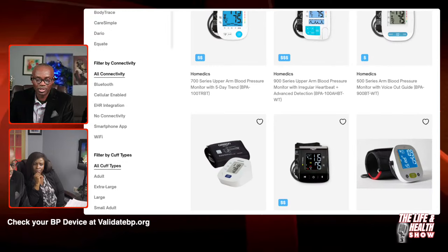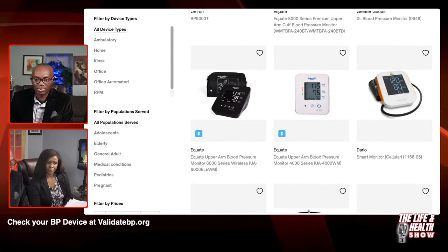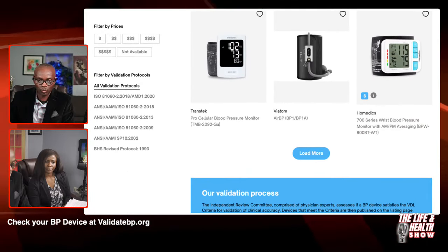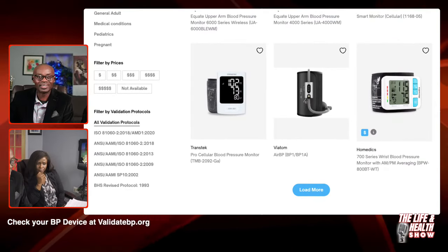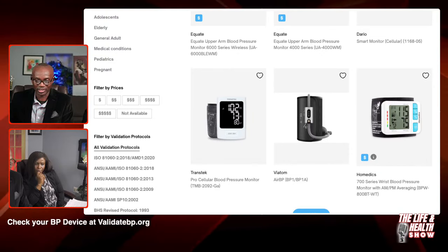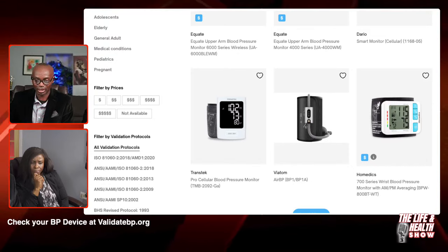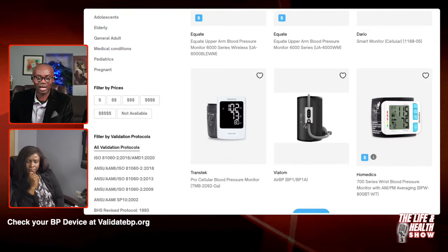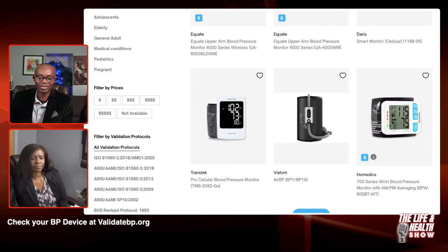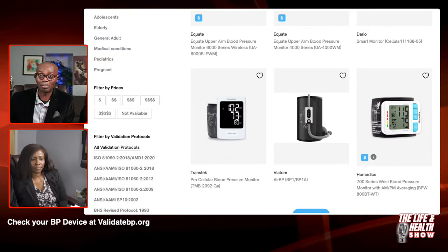If you already have it and you just want to check, you can punch in your model and just go to the site, validatebp.org, and whichever brand you want to check will be on there for you to see if it is one that has been validated or checked by a group of people to say that it is good. Because if it's not checked, then you buy it at your own risk. And I'm pretty sure there may not be all good ones out there. As much as there are good ones, there are definitely ones that may not be approved. We have a lot of machines that come from different countries and they may not have been tested or approved as being good ones. So don't just buy. Put it in this validation tool to see if it is something that has been checked by an independent body. Have anything to say?